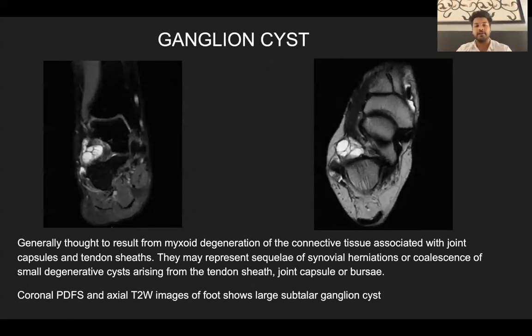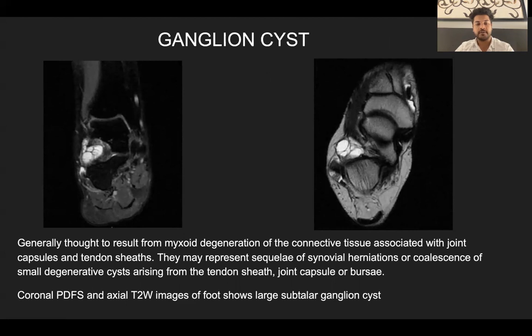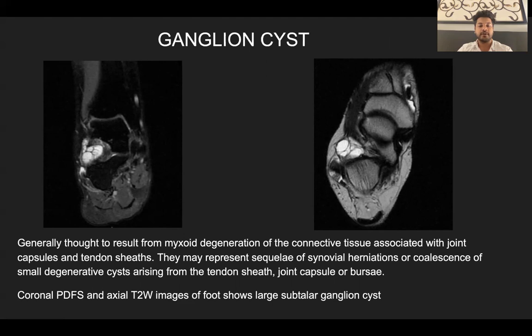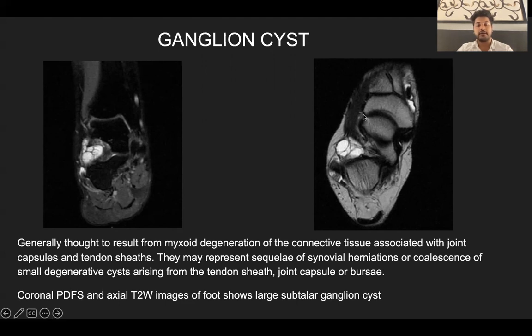The next common case was ganglion cyst. Ganglion cysts are generally thought to result from myxoid degeneration of connective tissue associated with joint capsules and tendon sheaths. They may represent sequelae of synovial herniations or coalescence of small degenerative cysts arising from the tendon sheath, joint capsule, or bursae. Coronal proton density fat-saturated images and axial T2-weighted images of the foot show a large subtalar ganglion cyst with fluid signal intensity.